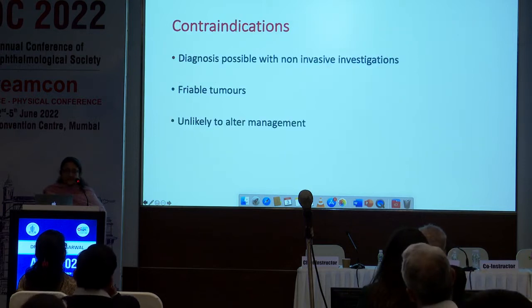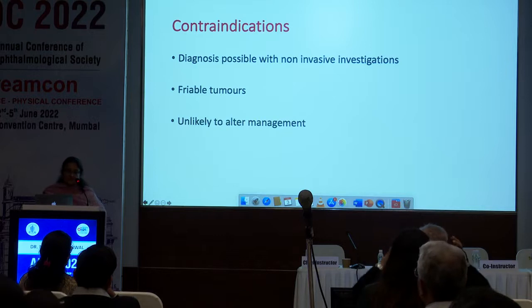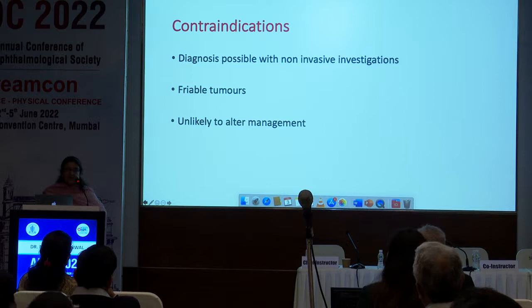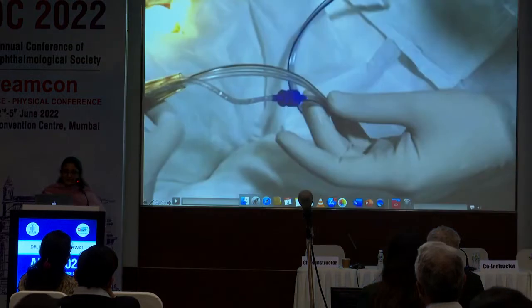As far as the contraindications are concerned, if you can make the diagnosis with a non-invasive investigation, obviously you're going to prefer that to doing any surgical intervention. Friable tumors, again, it may not be very useful and unlikely to alter the management. So if you decide that you're going to be treating this patient with steroids and the patient is showing a response, then there's no point disturbing the management, because in any case, you're not going to be altering your management. Now, this is a short video.